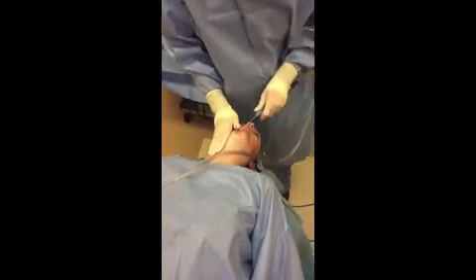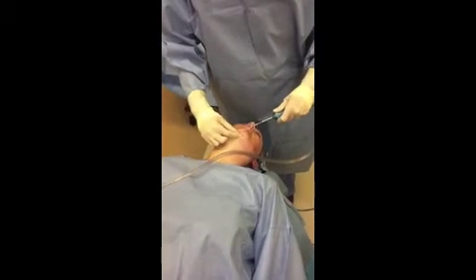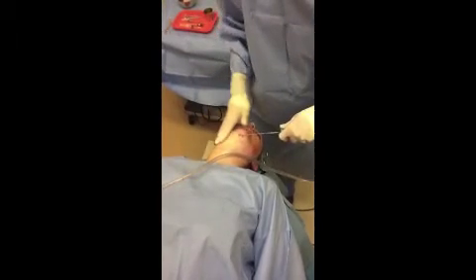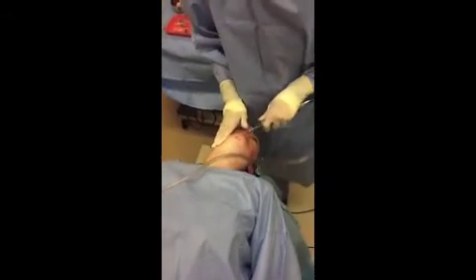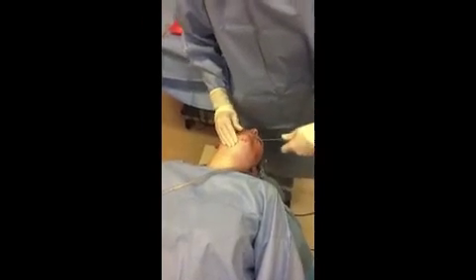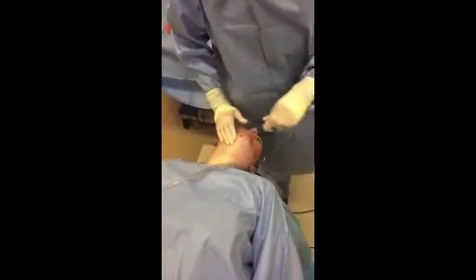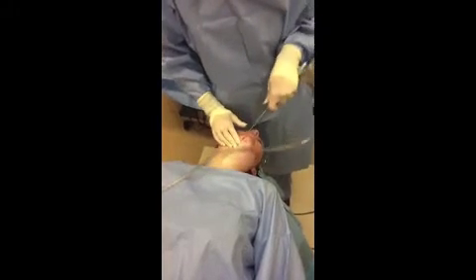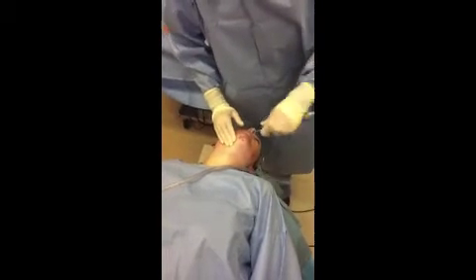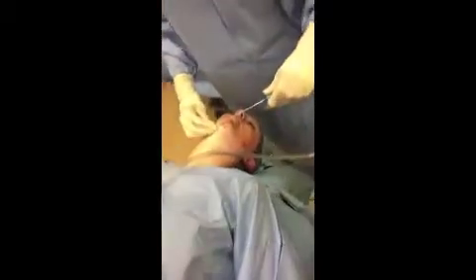You're checking along the cannula there. Yeah, I'm checking along the cannula to see if there's any fat left. So you can see there's some right there, so I'll go in with one of the smaller cannulas right here. That's an area that you really have to concentrate on, especially in Mary, because that's where really all her problem lies. And then you can see out here, there's really not much in the way of fat left. And these X's are to mark off that nerve that we want to be careful with.